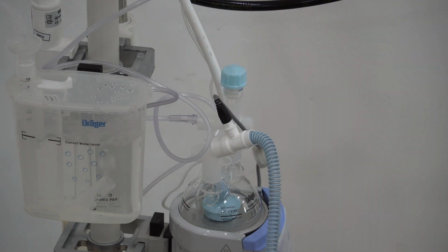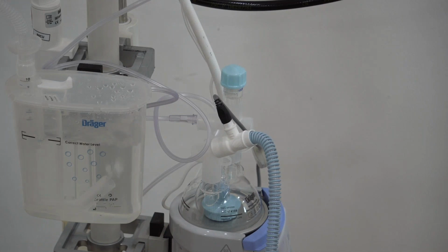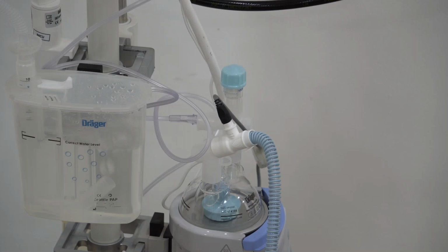But they were doing this in a research setting, and they discovered that the volume produced from the 135-degree angle tube is higher than the volume produced at 90 degrees, the vertical tube, and thus provides better respiratory support to the babies when performing the Bubble CPAP therapy.